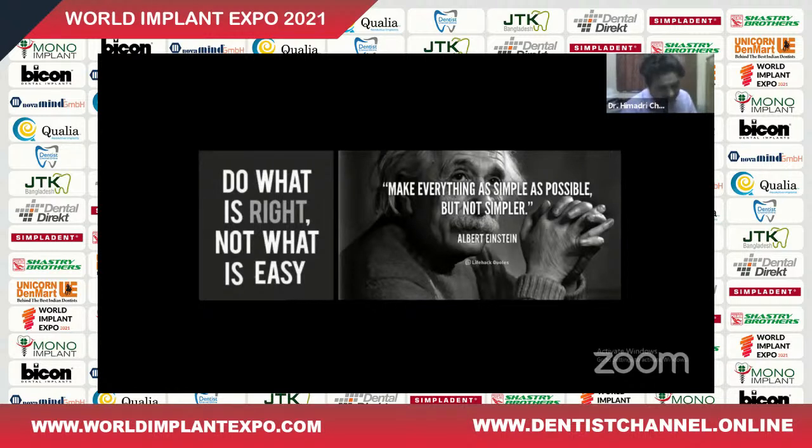I have told you that you need to follow the path principle. It might be a little bit tedious to do periosteal stripping, mobilizing the flap, curating the sites, placing the bone grafting layers, stabilizing the membrane, then suturing in layers and postoperative care. But that's absolutely right. That's not what is easy, but you need to follow this path.